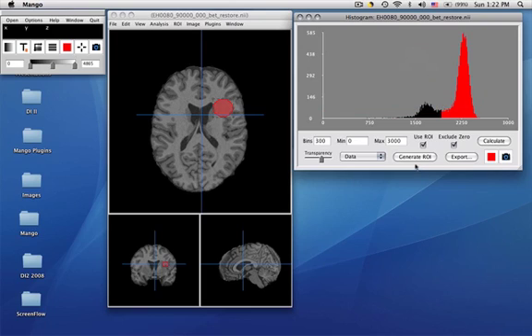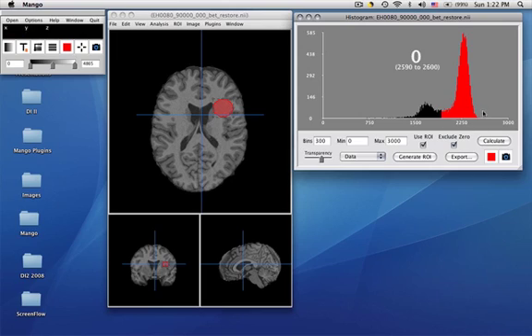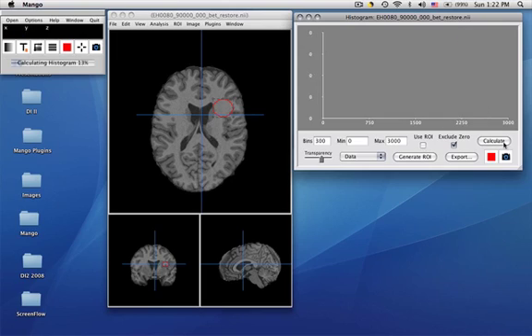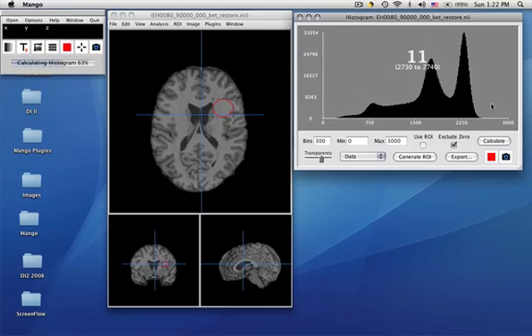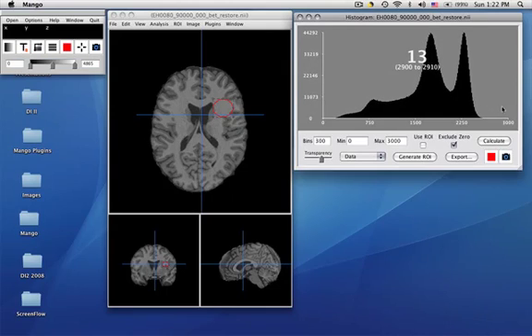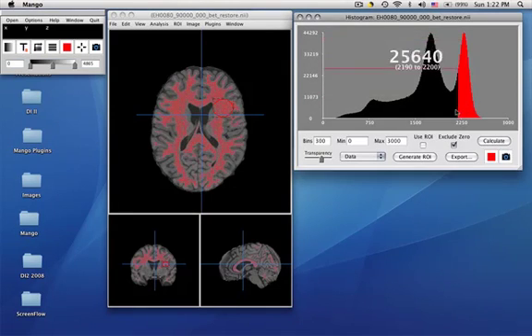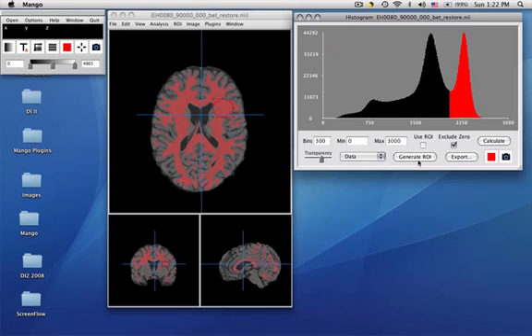And if you wanted to generate a real region of interest for what you'd highlight with here, you could press another, this button and do so. More often we find that we want to generate the region of interest from the full image, which we might highlight a range like that. Say generate ROI, then we'd make this large ROI.